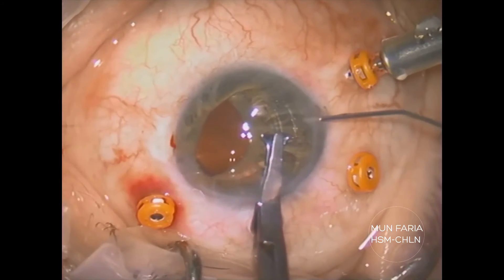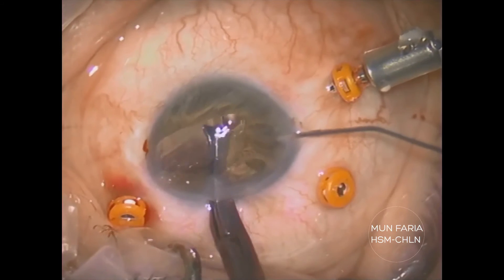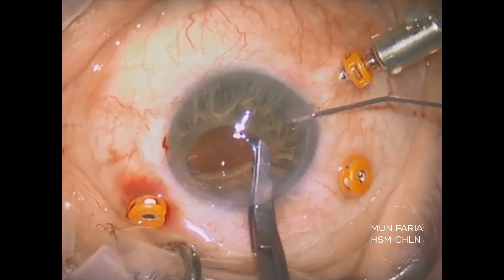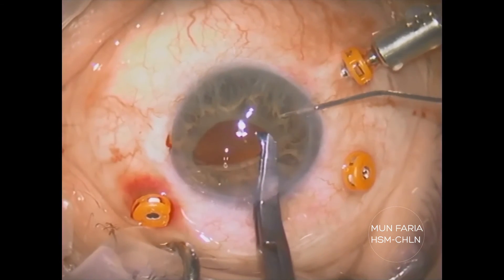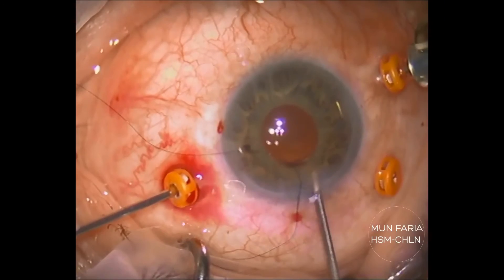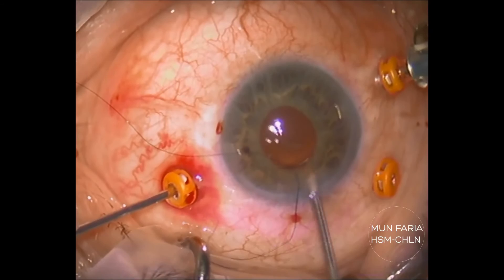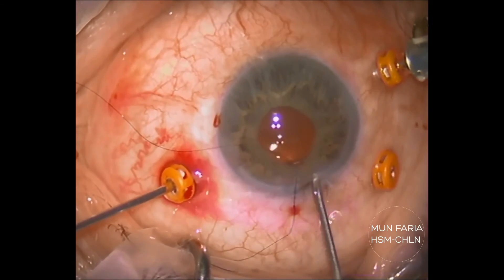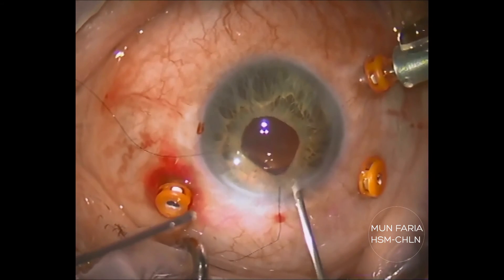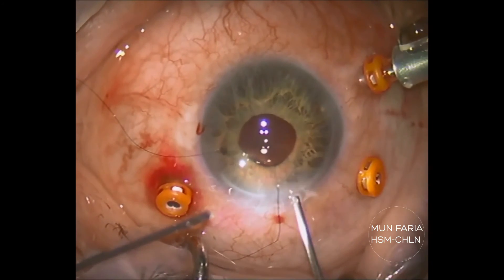In this particular case, the patient was a high myope and needed a negative IOL. We tried and managed to insert this flexible Artiflex IOL through 3.2 millimeters. Enclavation was easily made holding the IOL near the hard PMMA haptics and not on the flexible body. A suture was placed for astigmatism control.